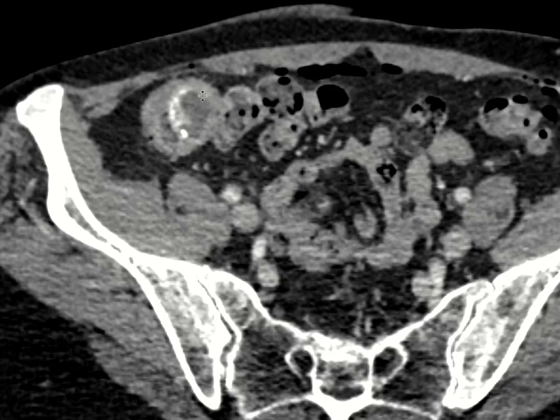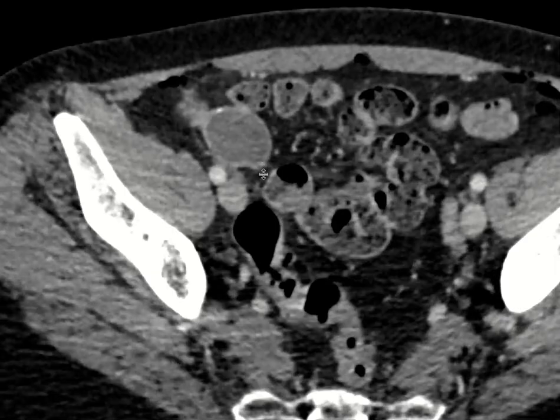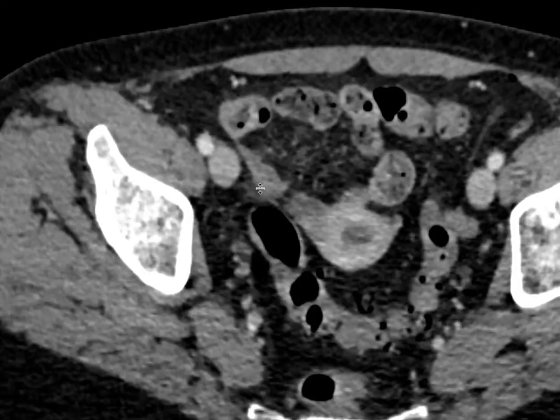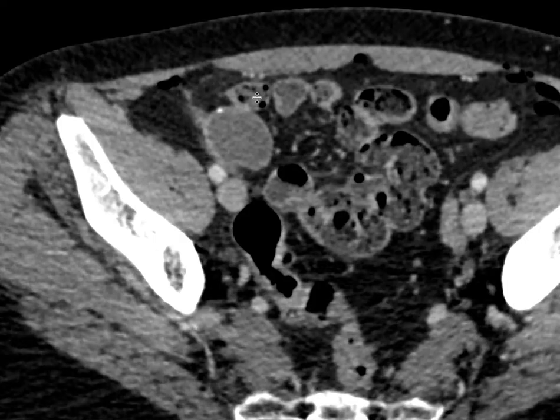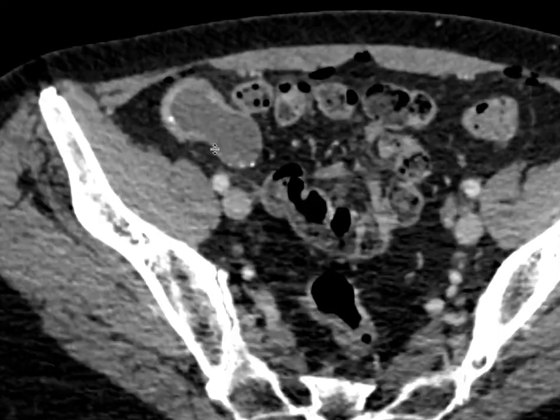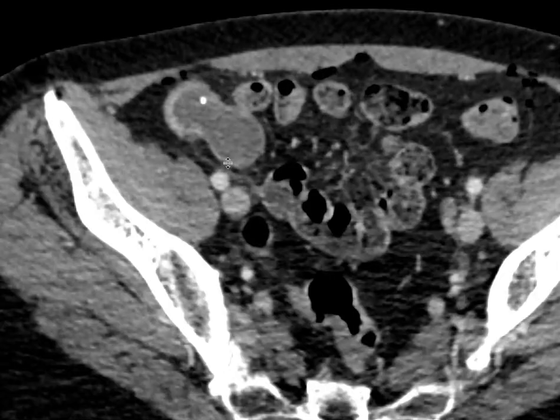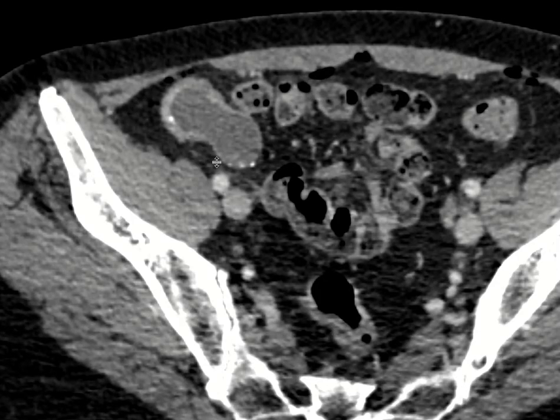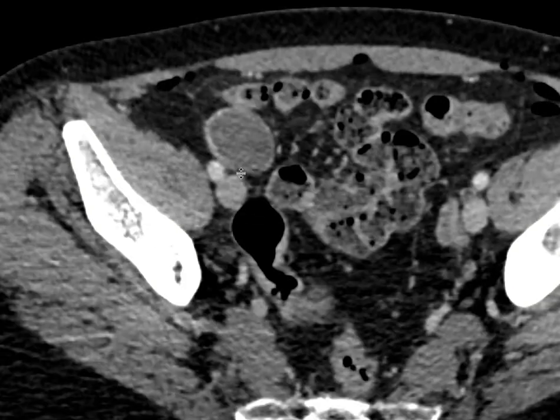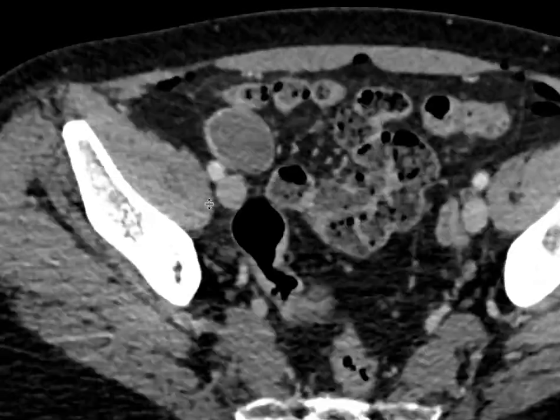And we can see that there's a really thickened appearing appendix that's emanating off of the cecum. The appendix itself is here measuring, let's put calipers on, about 25 millimeters in diameter. And there's some areas of calcification along the edge of it. The other thing to note as well is that the wall of the appendix is not particularly thickened. This seems to be material inside the appendix that's dilating it up.